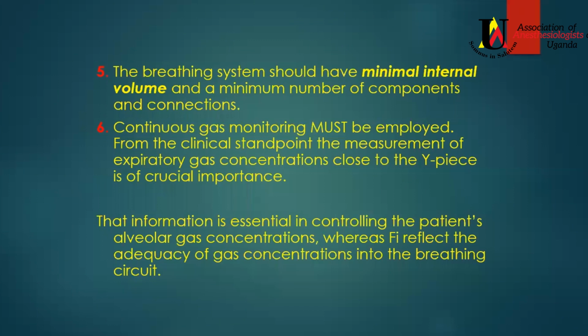You must have continuous gas monitoring. There is no way you're going to run low flow anesthesia if you don't have this. It's going to be very hard for you to know how much you're actually delivering to the patient and how much the patient is getting.